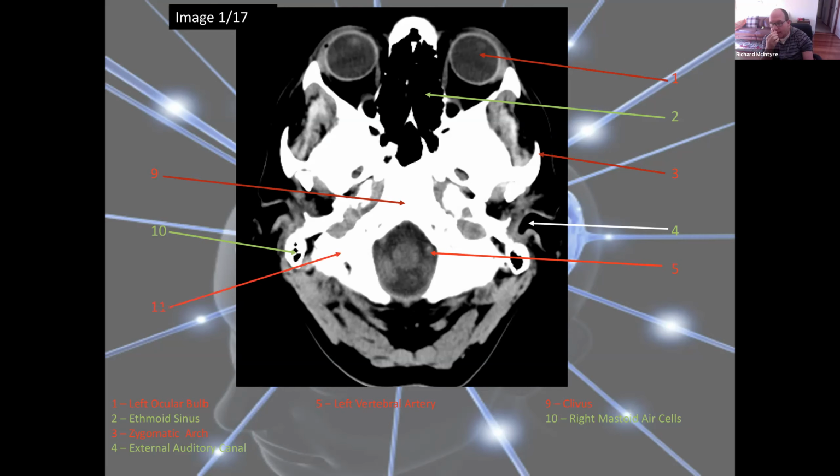What sort of bone is that? It's their occipital bone. Very good. I hear everyone say, 12 is the spinal cord. You can see the intensity of that structure. That structure has absorbed a little bit more radiation than the structure around it. Okay, so fluid, but not nearly as much radiation as the bone.